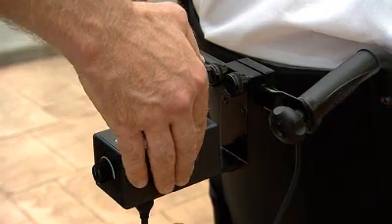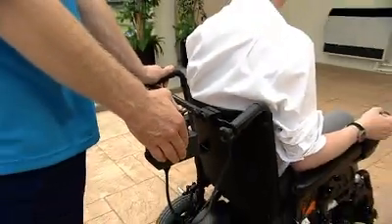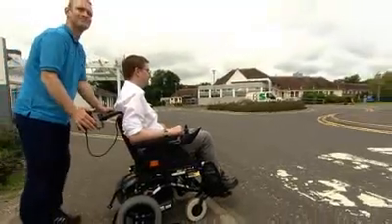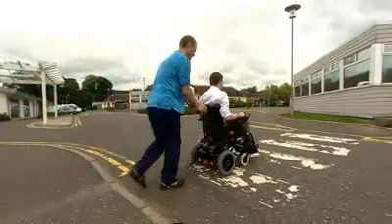The direction the wheelchair travels in varies according to the direction of joystick movement. When driving on a flat surface, the speed of the wheelchair varies according to the amount of joystick movement.